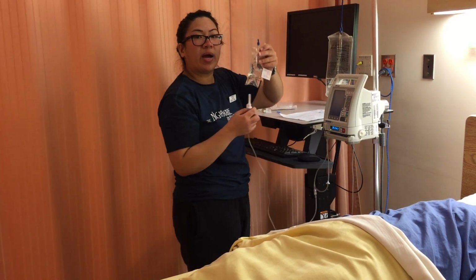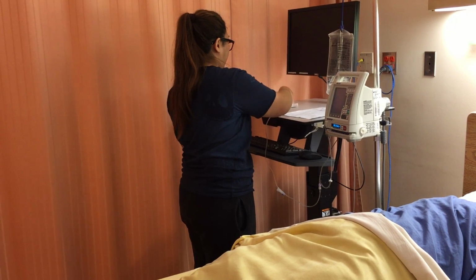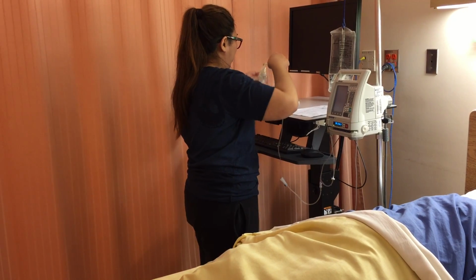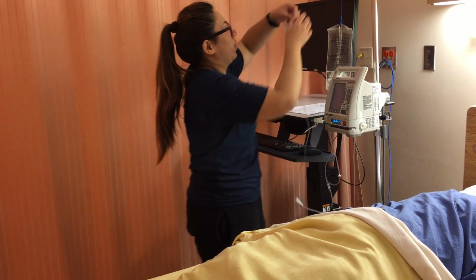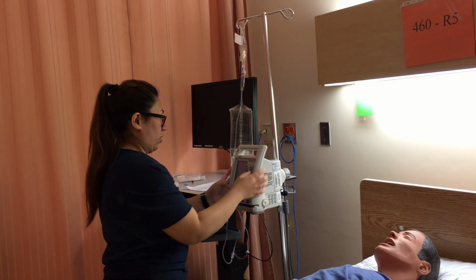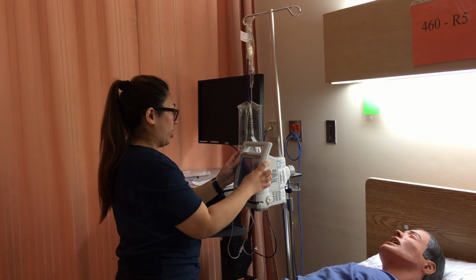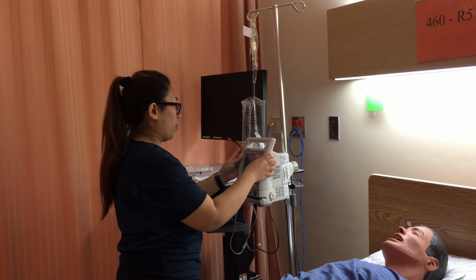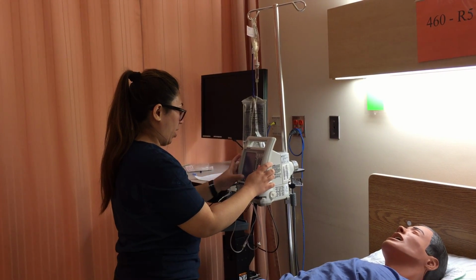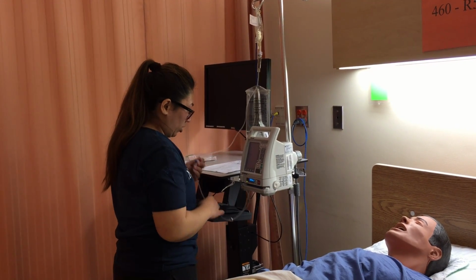Now we are ready to spike this secondary medication, and it is ready to hang. Because I have 107.89 here, and I would run it for an hour, I would put 108 mL per hour. The volume is 108 mL. Confirm secondary and start. Make sure all clamps are open.